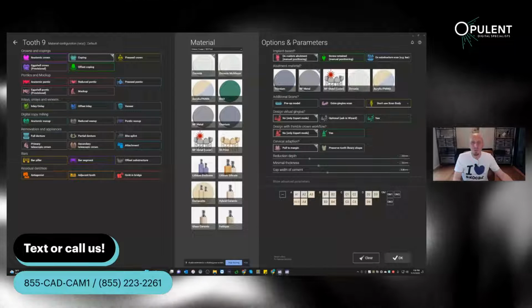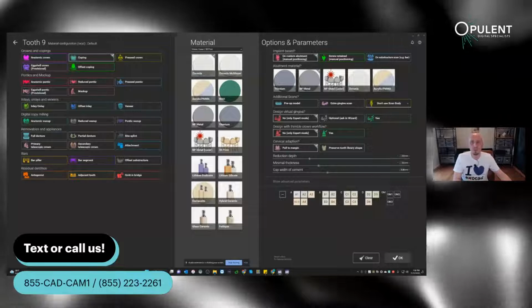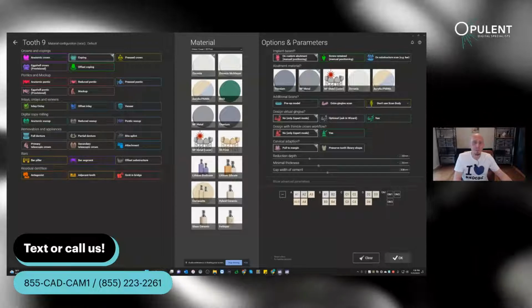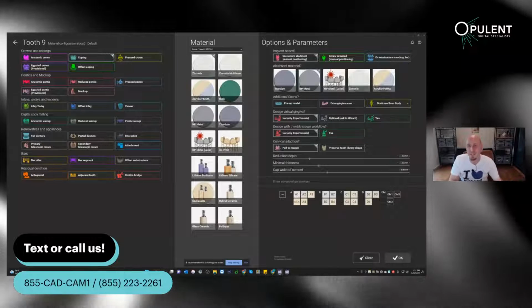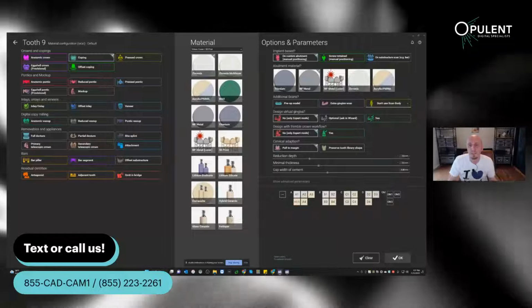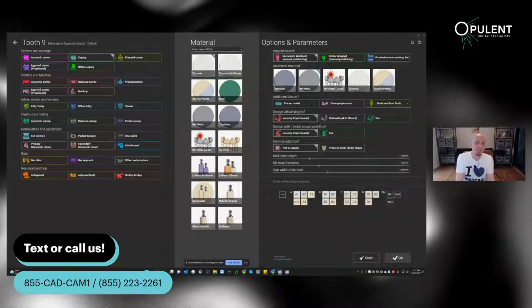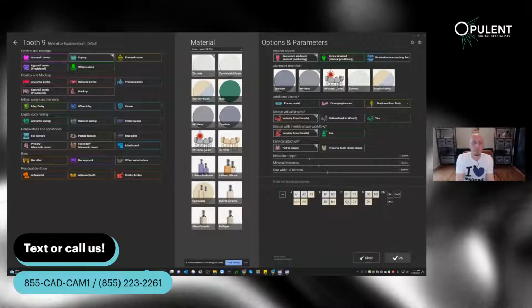I'm stuck here and there. Do you know, you do those implants all the time, right? Yeah, I got a library for you. Where do you get it from? I got it from the rep somehow, and it's an unofficial version, but it comes from them, and it's getting sometimes a little messy. And I guess that's exactly the point why Exocad is trying to make this all a little easier and streamline this. And it's not the norm, but it will possibly happen too.